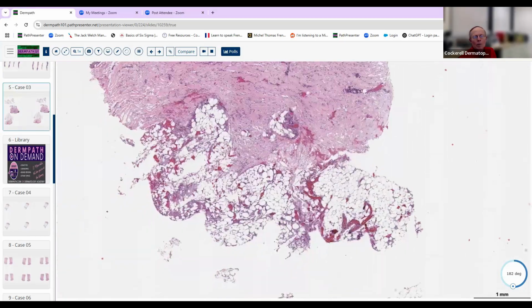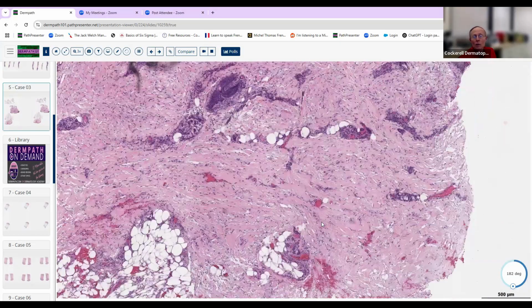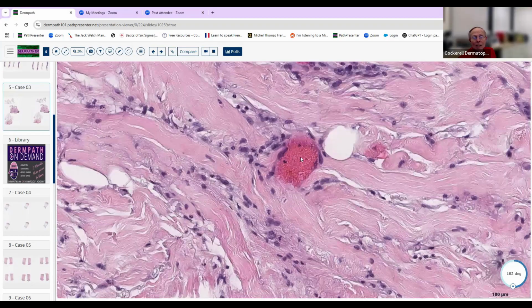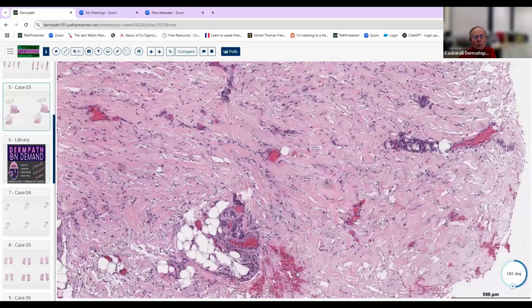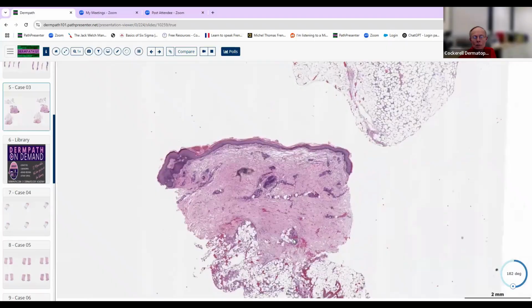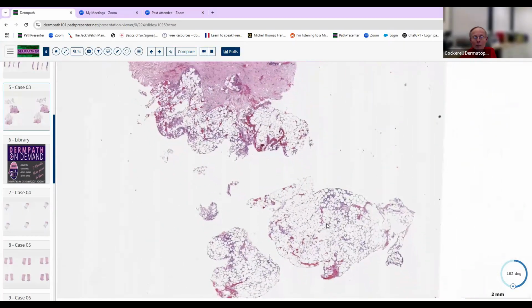They would show something that you could make the diagnosis from, but at least in a case like this, you should be very concerned about some kind of thrombotic process. That blood vessel, again, is not normal. There's something going on here. And that, coupled with the epidermal necrosis and sweat gland necrosis, you should definitely be thinking about some issue that caused ischemia. Coma blister theoretically could look something like this.